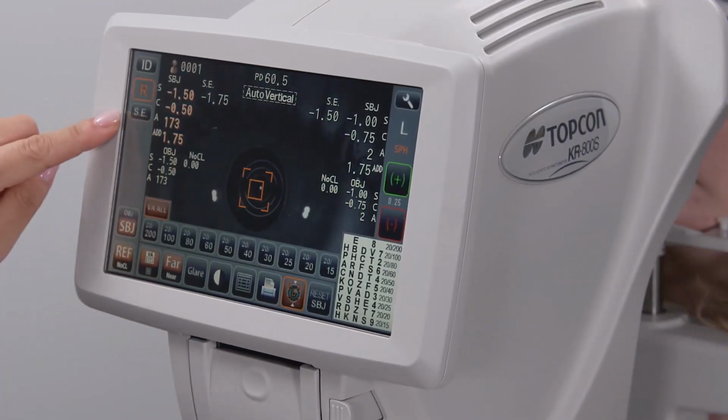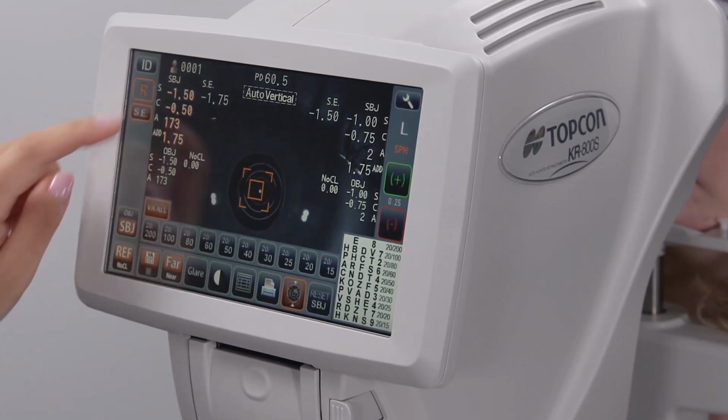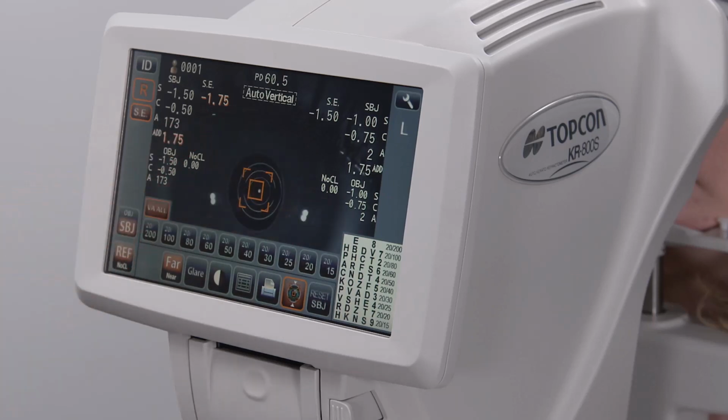The spherical equivalent icon can be used to convert the patient's autorefraction into a spherical equivalent. This feature can be used to show a cataract patient the difference between choosing a premium toric IOL by having the spherical equivalent icon off and a basic spherical IOL by turning the spherical equivalent icon on.